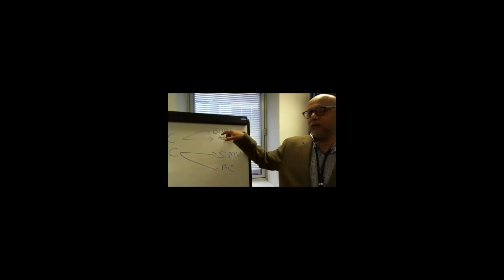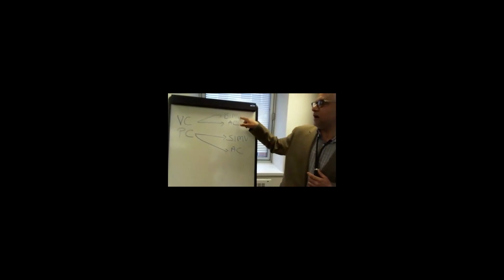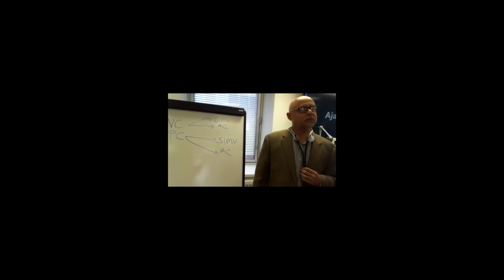So, for example, 12 is set, patient is taking 18 breaths. 12 are given by the machine. The 6 extra the patient has to take. We want the patient not to tire out. We want the patient to get at least some help, so they get pressure support when the patient takes a breath in. It decreases the resistance of the tube so the patient can breathe a little easier. What is the advantage of this? Theoretically, it prevents atrophy of the breathing muscles. But there's a controversy about whether it really helps or not, as well as about SBTs, trials, and other things. But that's a whole different subject.